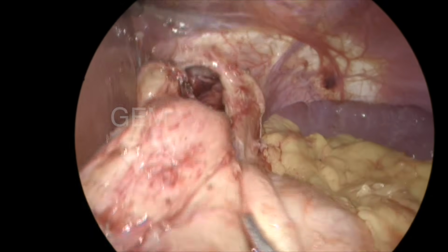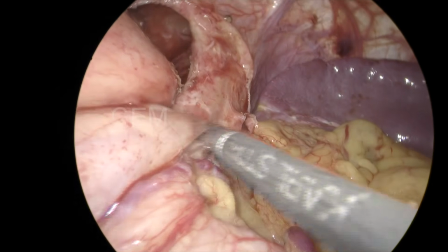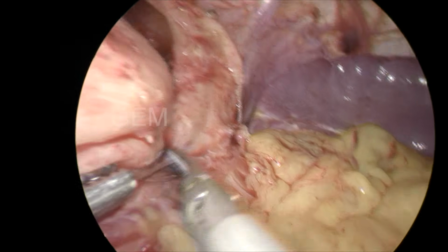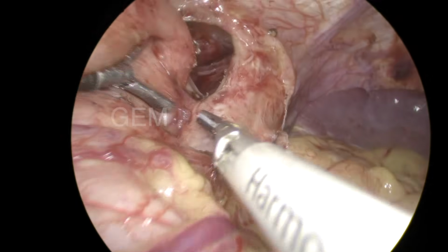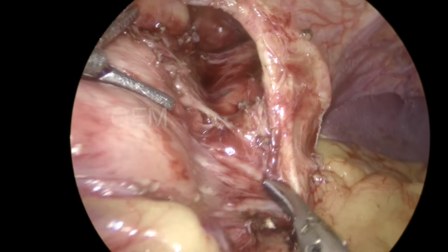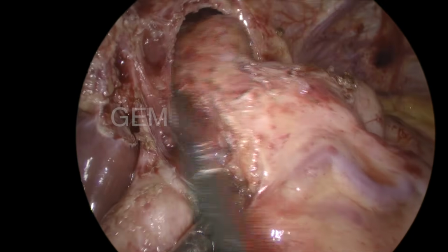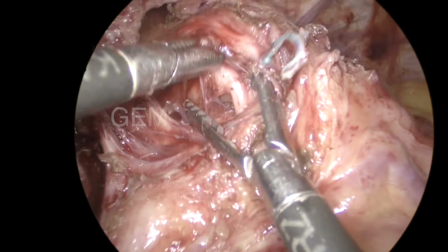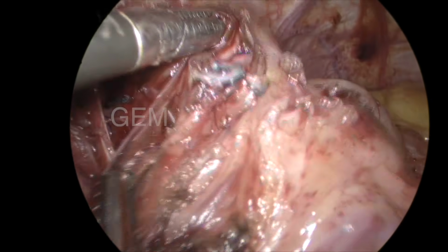I am going on this side. See again, you can see the left crus, the left pillar of the right crus. Again some attachment is there. I am dividing all the fibrous attachments. See, that is the posterior vagus. You can see the posterior vagus.